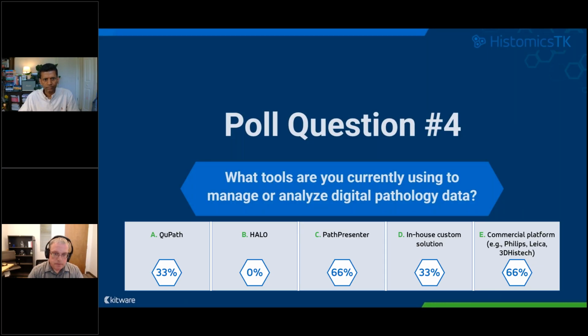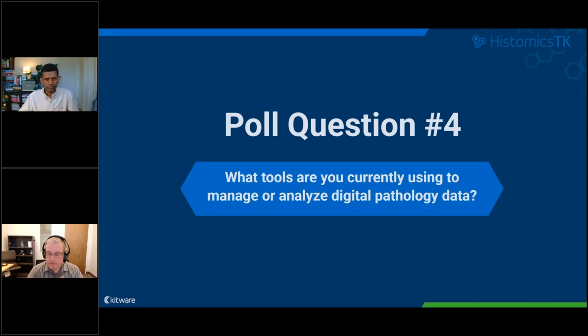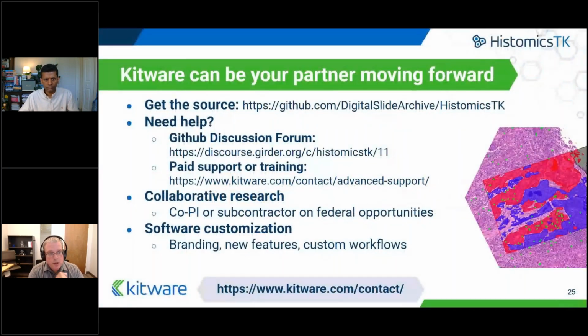Great. Okay. And then just to end up, where can you find the source? There's a link here to some of the source that's distributed in a couple of different Git repos, and we'll include more of that with the follow-up email.